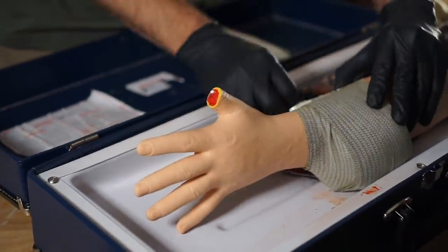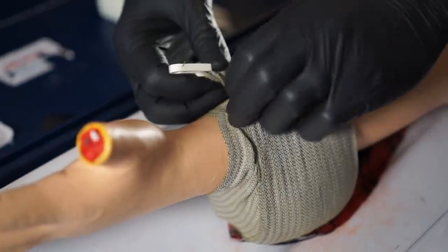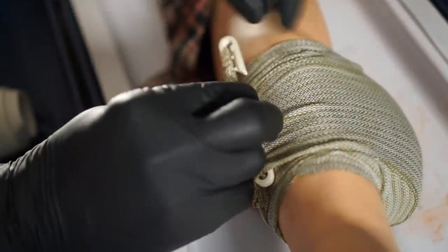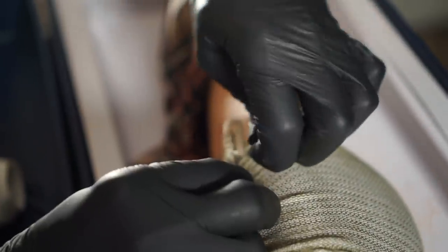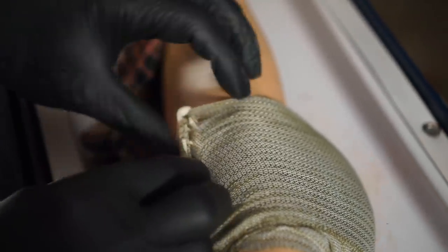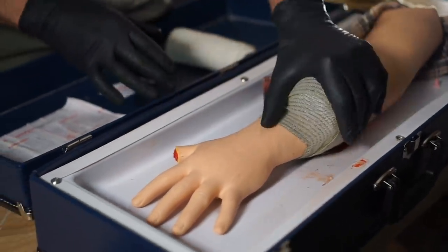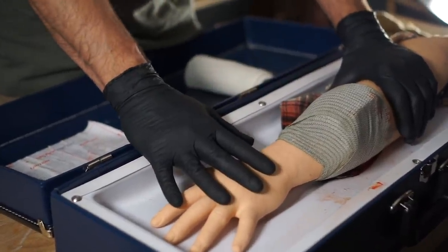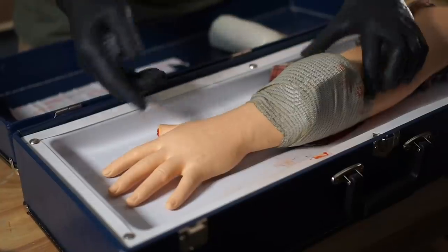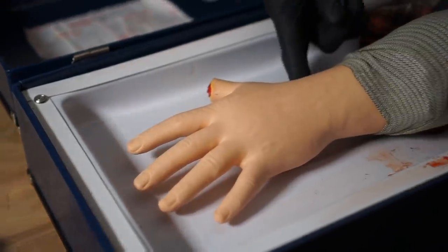Once I get to the end, I'm going to have a second cleat. All you have to do is bring up a layer, set it inside — it will capture on those teeth and that cleat. Bring up another layer on the other side and capture that. What I don't want is a tourniquet effect. This pressure dressing replaces my manual pressure, but it should be about one finger tight, still have reasonably good capillary refill, and you should still be able to feel a radial pulse.